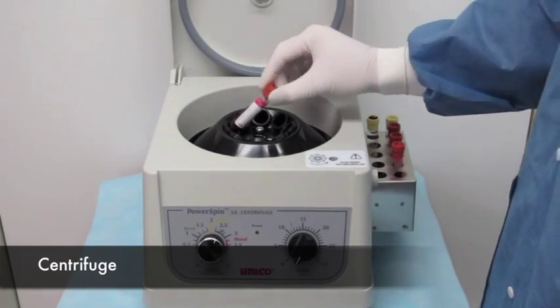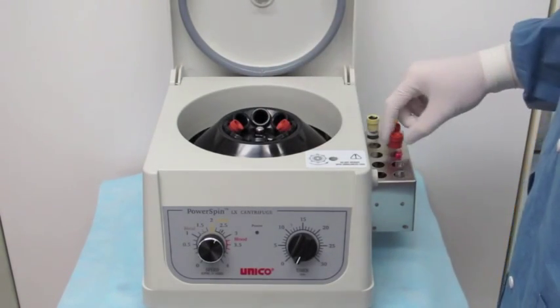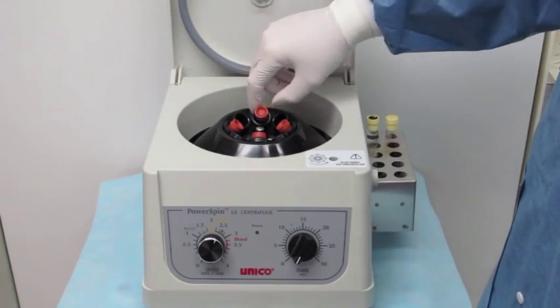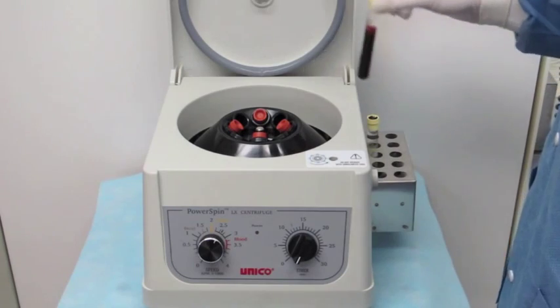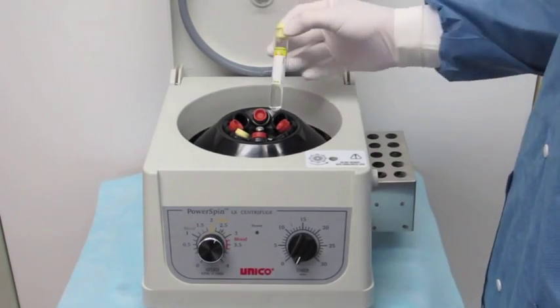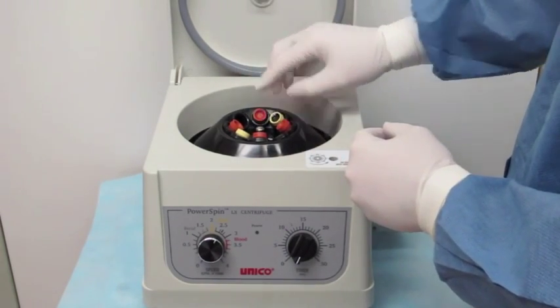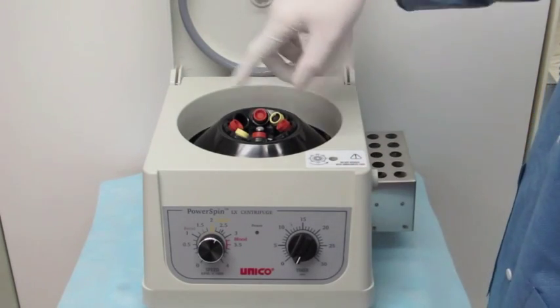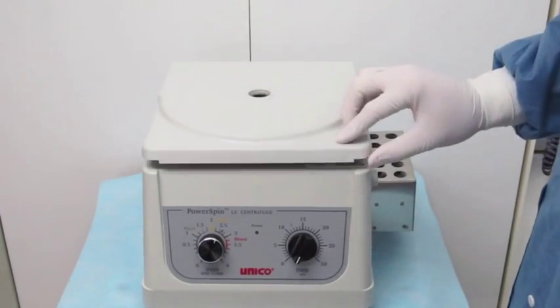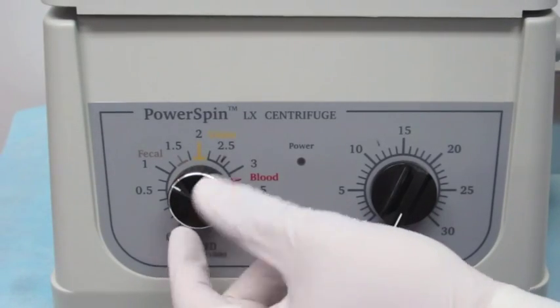When you bring the tubes to the centrifuge, place them opposite each other so they have equal weight on both sides, and as the centrifuge spins it won't rock back and forth. If you have an odd number of tubes, take a blank tube, add some water to it, mark it so you know it's a balance tube, place it in to equalize the weight, close the lid, and turn the centrifuge on to the required setting.